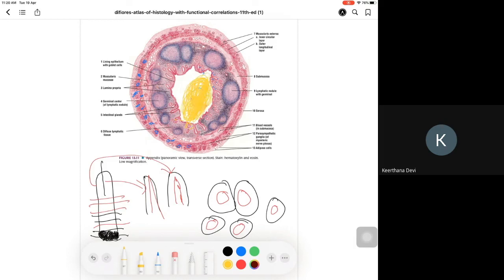Another common pathology we see in our country is a lot of eosinophils. That is known as eosinophilic appendicitis. You cannot call it chronic appendicitis. It is eosinophilic appendicitis. Then you may see some bugs in the lumen, Enterobius vermicularis, and then carcinoid tumor in the tip of the appendix. So in the appendix, you have to look for these things. Number one, acute appendicitis. Number two, eosinophilic appendicitis. Number three, oxyuriasis. And number four, carcinoid tumor. There is no chronic appendicitis, there is no subacute appendicitis in pathology. They are all clinical terminology.